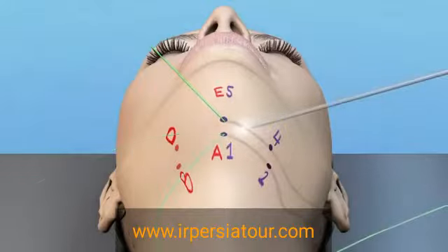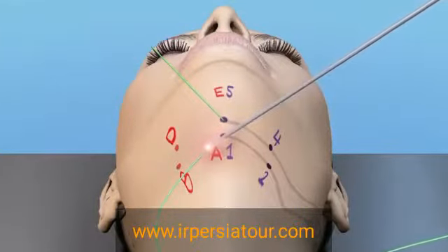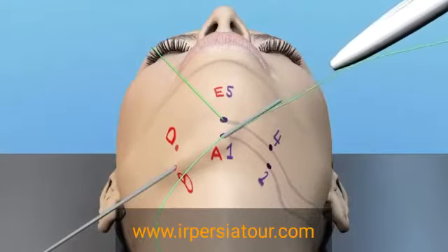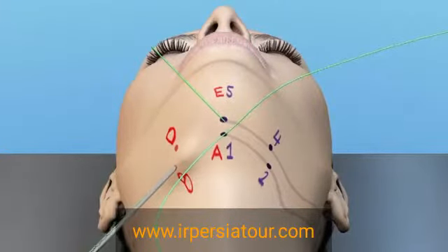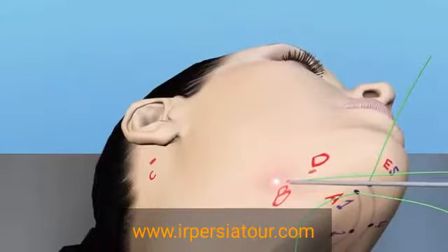Remember, do not cut the suture. It'll just be tied here when both limbs are threaded in the subcutaneous space, and then the suture will be continually weaved anteriorly using the trampoline platysmoplasty procedure. The right limb of the neck-defining suture is then placed in the same fashion through each puncture site.